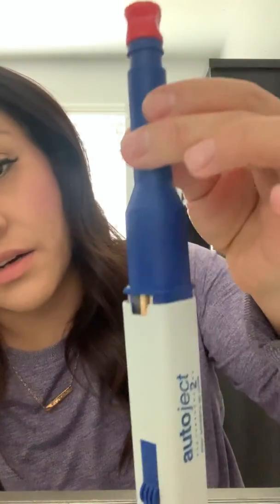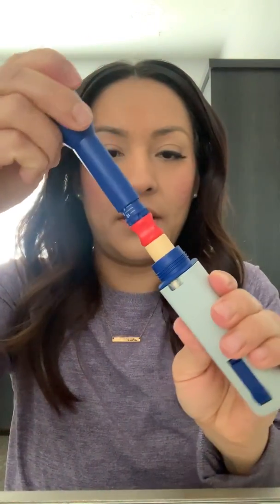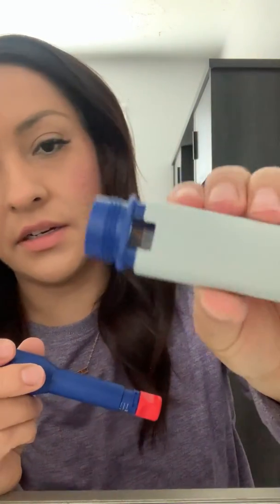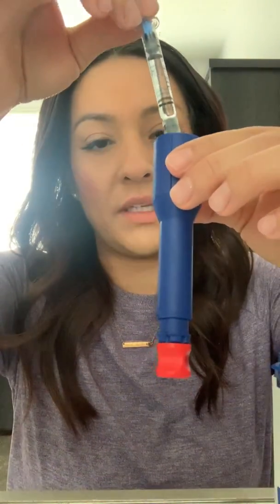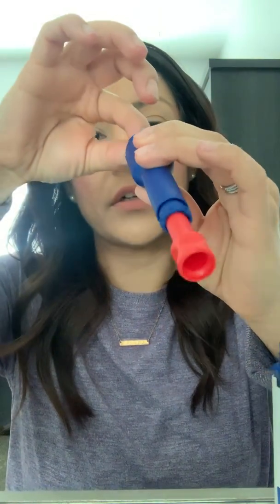And here is the auto-injector. So you undo it, and then you just put this upside down and cock it like a gun. Okay, so now that's pushed in there — I'm shaky. And then you take the syringe, and again, you just leave the lid on. You don't have to take the lid off because it's going to take it off for me. And you just push it all the way in there. So that's ready to go.